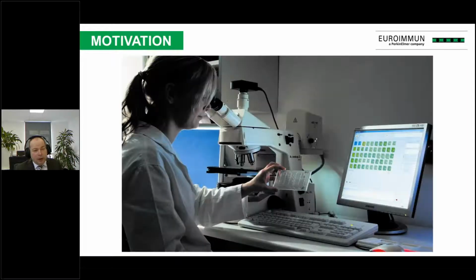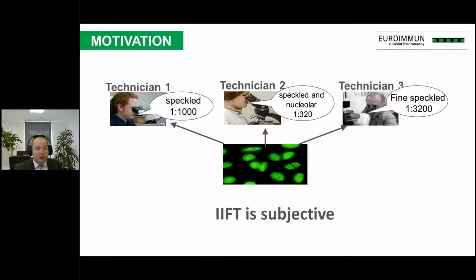Now, I would like to give you a short motivation why automation for immunofluorescence is so important. The immunofluorescence microscopy setup in most laboratories is cumbersome. The microscope is often located in the darkroom. An automatic microscopy can avoid this darkroom and help to accelerate the assay evaluation.